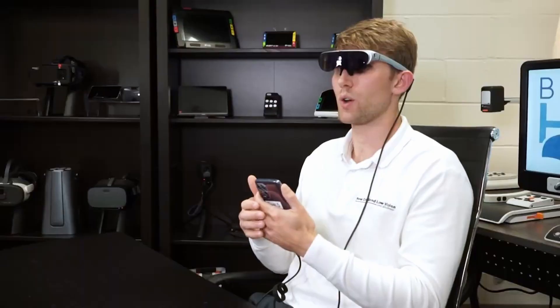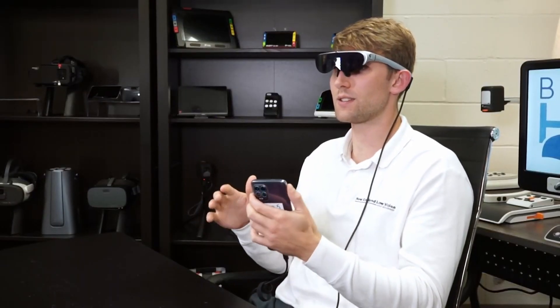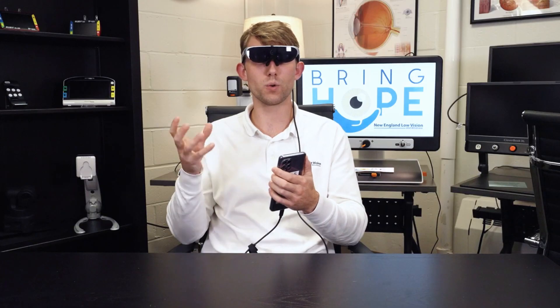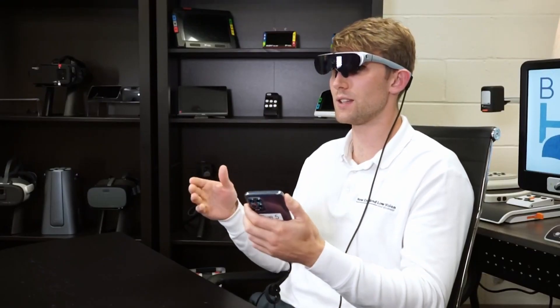If I wanted to read text, I would use the command 'read this text' or 'what is this text?' — it's not very picky on what you say, so you can say it in any verbiage that you wish. Ivy, who is the AI assistant within this device, will let you know what you want. I can do this operation for any scene description or text reading that I would like.